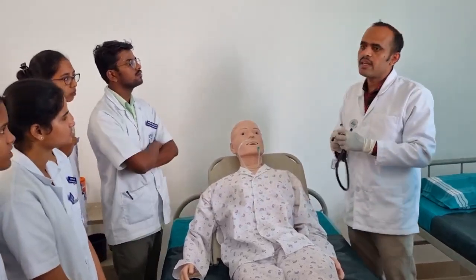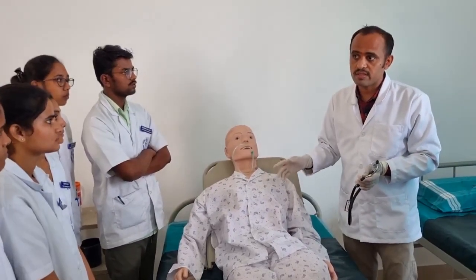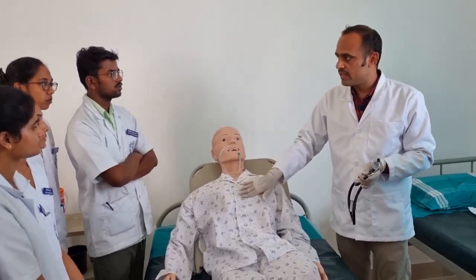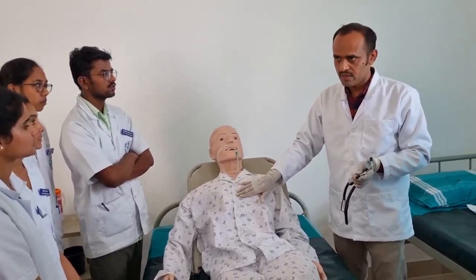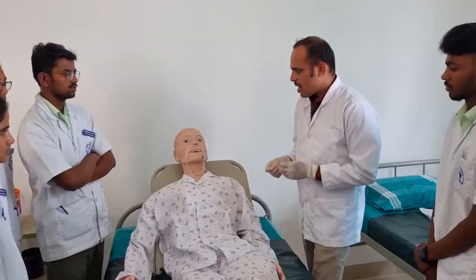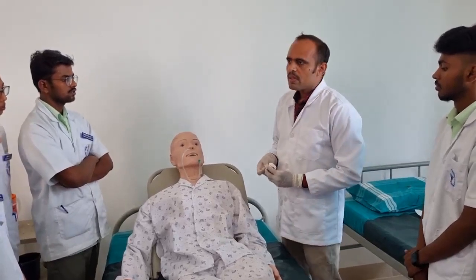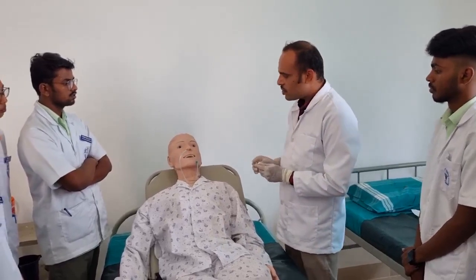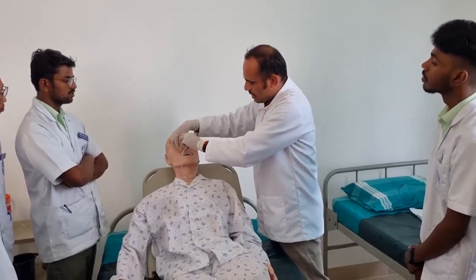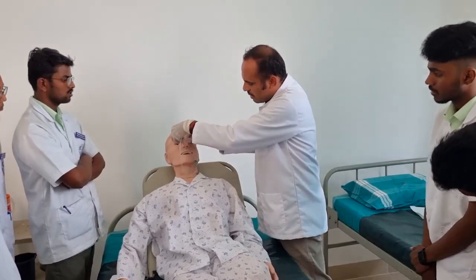But exactly how do we confirm whether the tube is in the stomach or somewhere else? The actual method of confirming is by X-ray. They will do the X-ray, and after that they will confirm whether the NG tube is in the stomach. Then we have to secure the NG tube with the sterile pad, sticking it at the nose.